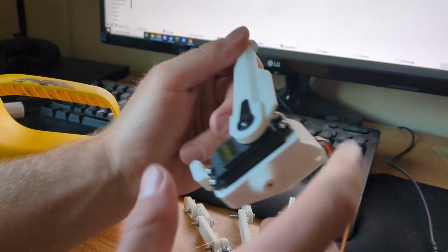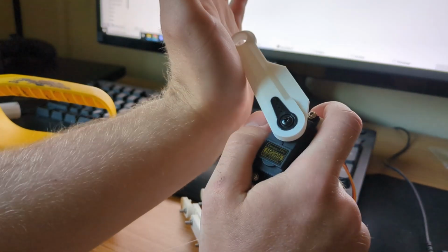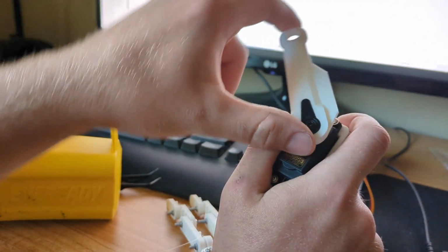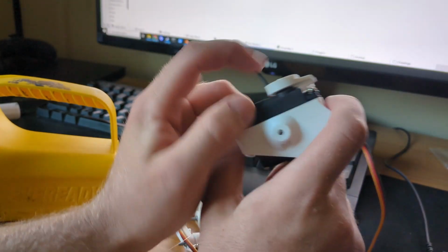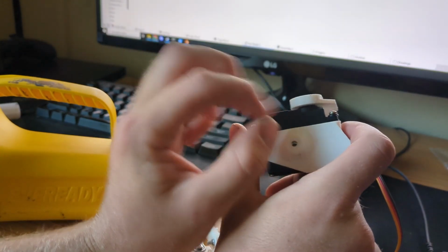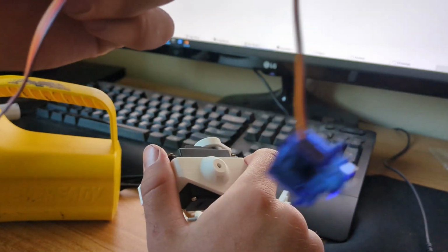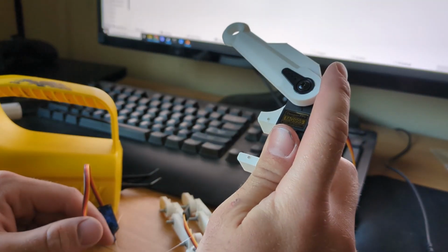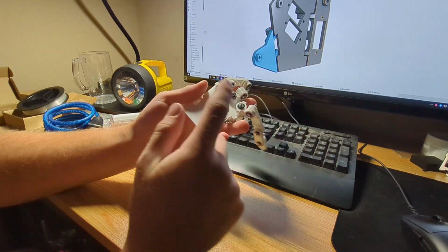That's the big one. So if this is under load, it's not the greatest thing to be back driving it. Say its target is to go this way and I'm stopping it, right? Servos have a bunch of gearing inside. They're really small motors just with big gearing. So it can cause gears to skip or break, especially on the little blue motors. These bigger ones might be a little more resilient. So switching motors might be very beneficial. All right, so I mentioned needing to change the servo sizing.